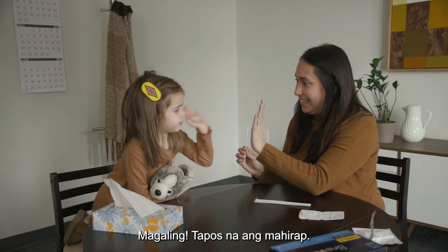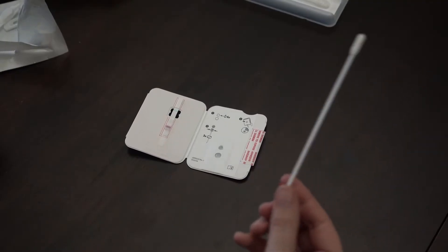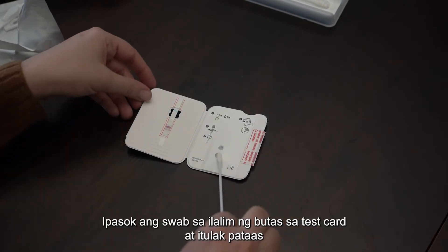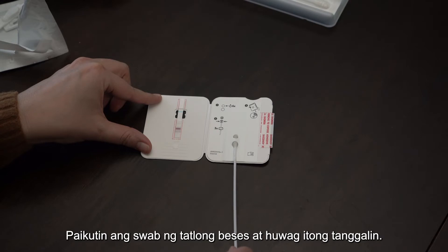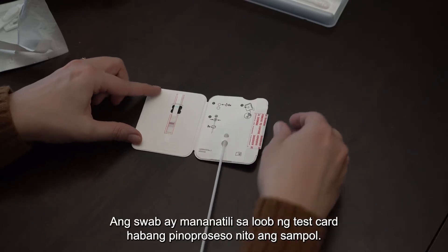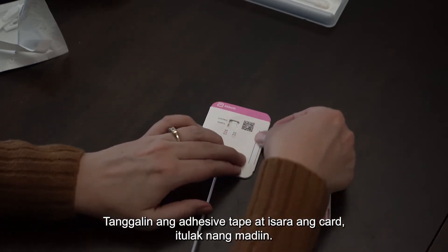Good job! The hard part of the test is over. Insert the swab into the bottom hole in the test card and push upward until you can see the tip in the top hole. Rotate the swab three times and do not remove it. The swab stays inside the test card while it processes the sample. Peel off the adhesive tape and close the card, pushing firmly.